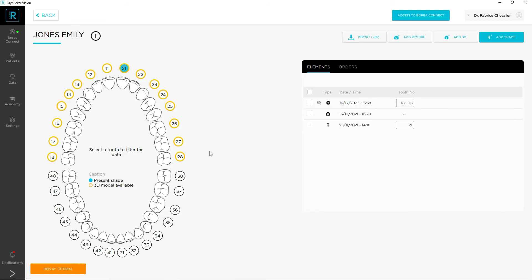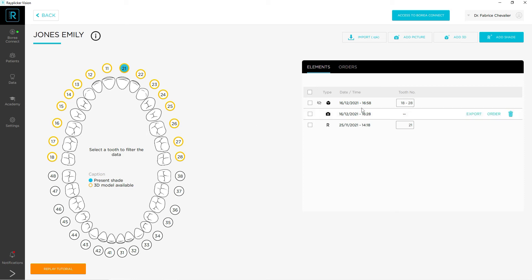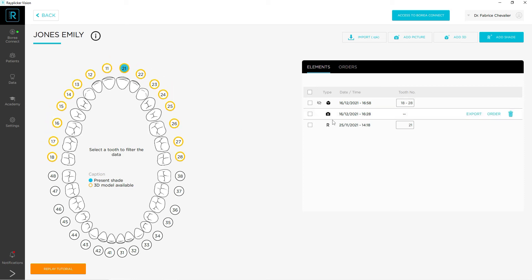You will be able to find the 3D file in yellow on the arch on the left of your screen, but also in the list of items in your patient file on the right.